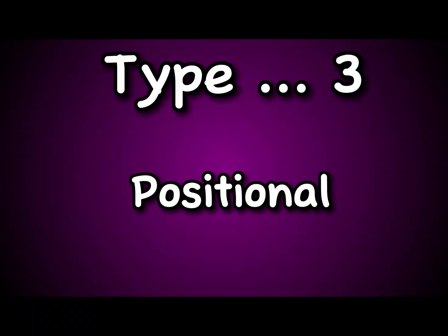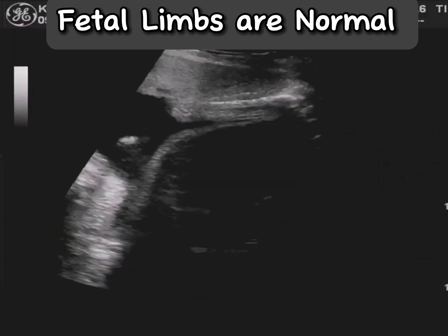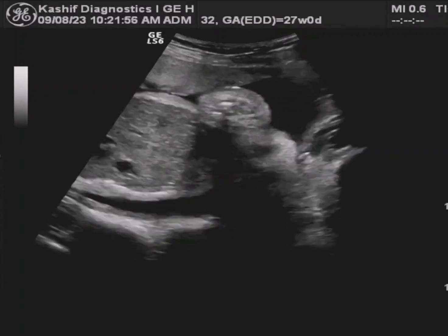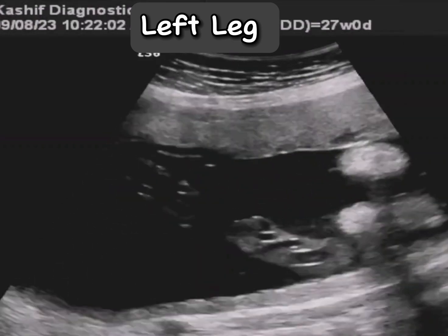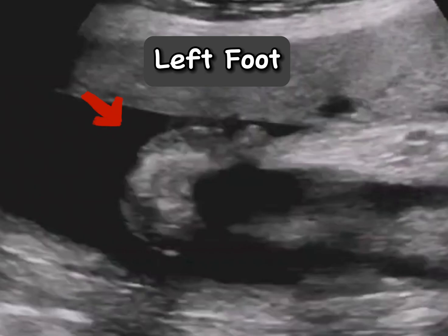The third type is positional club foot, caused by fetal position in the uterus, especially if there is decreased amniotic fluid. Ultrasound can diagnose club foot abnormality from 15 to 16 weeks of pregnancy.